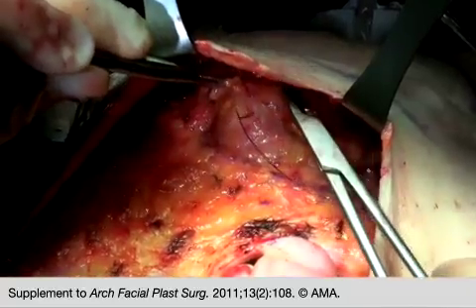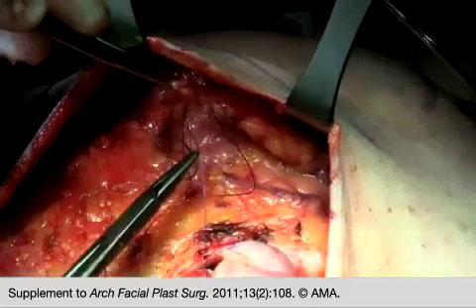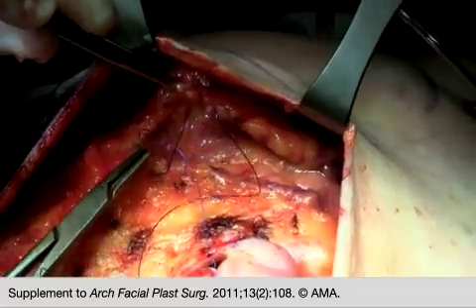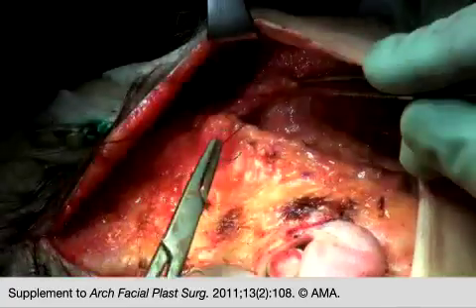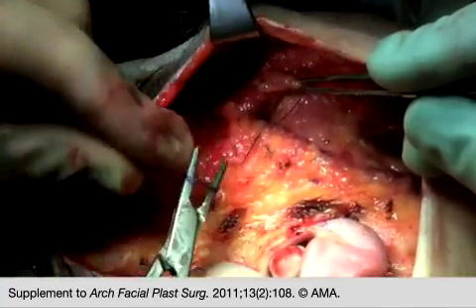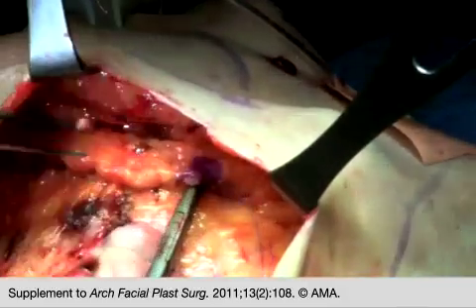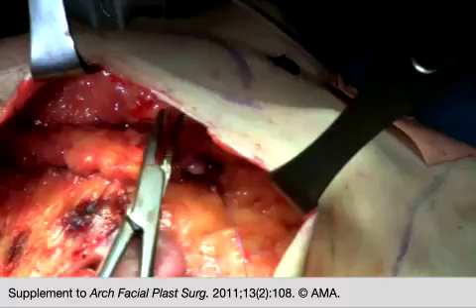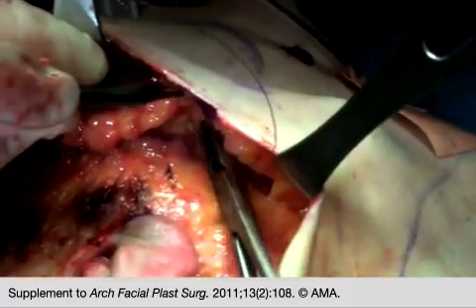Suture suspension of the SMAS flap begins at the malar eminence and proceeds inferiorly to the fascia of the sternocleidomastoid muscle. 3/0 PDS horizontal mattress sutures are used to secure the SMAS flap in place. Great suture tension is applied to the flap for maximum flap advancement.